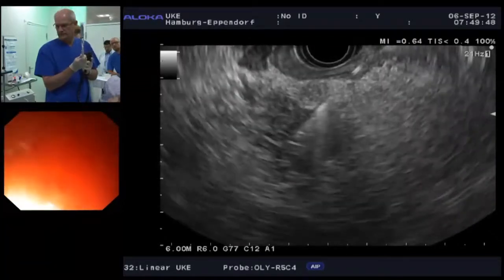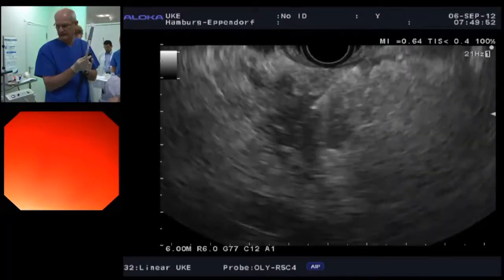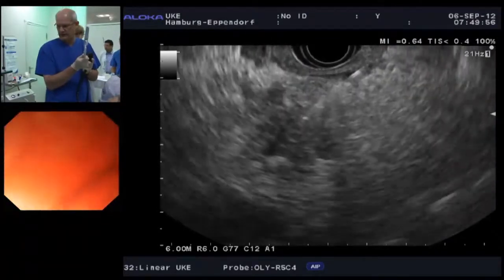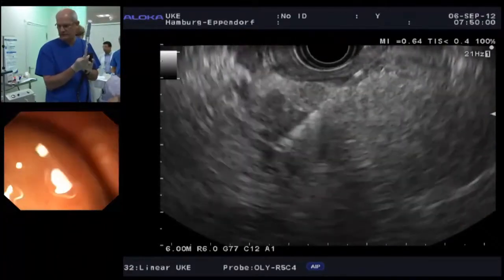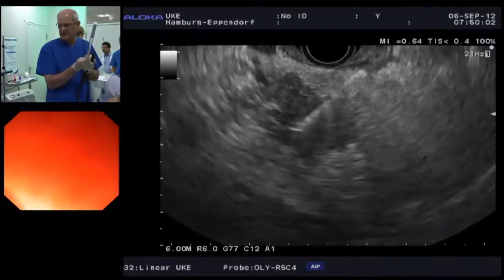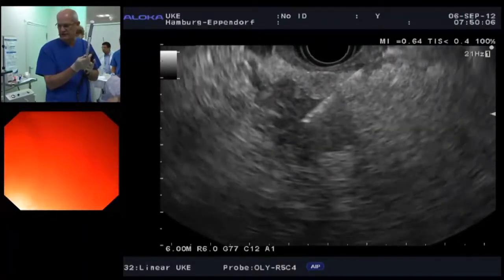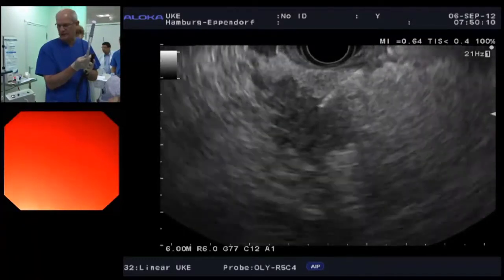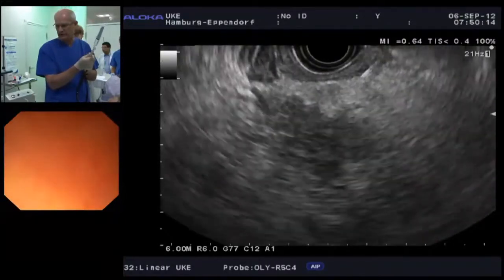Rob, if you don't have a cytologist present, how many passes do you do? Yeah, great question, Mike. And it's a good segue into some of your research. I think the bottom line is there's a little bit of a mixed message, but I think it's somewhere between 6 or 7 biopsies for a pancreatic lesion and probably about 4 passes for a lymph node to get that maximum result that we want.